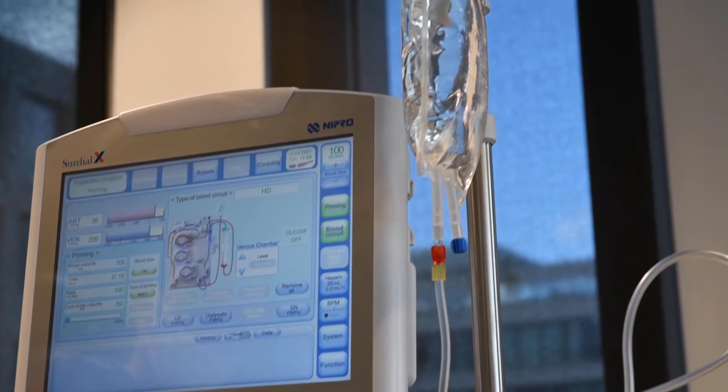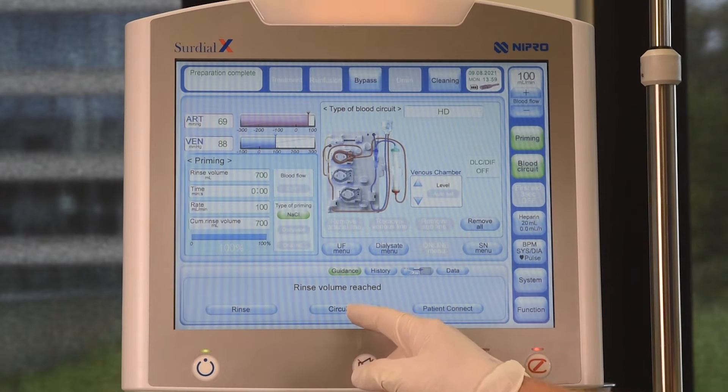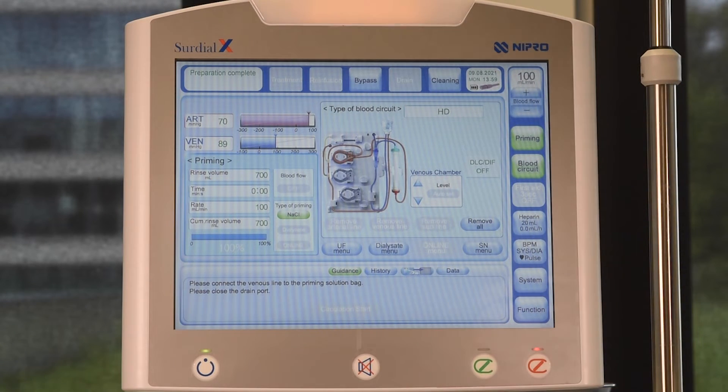The machine is now ready for treatment. For circulation, press CIRCULATION and change the saline bag if necessary. Then connect the venous line to the saline bag as well.